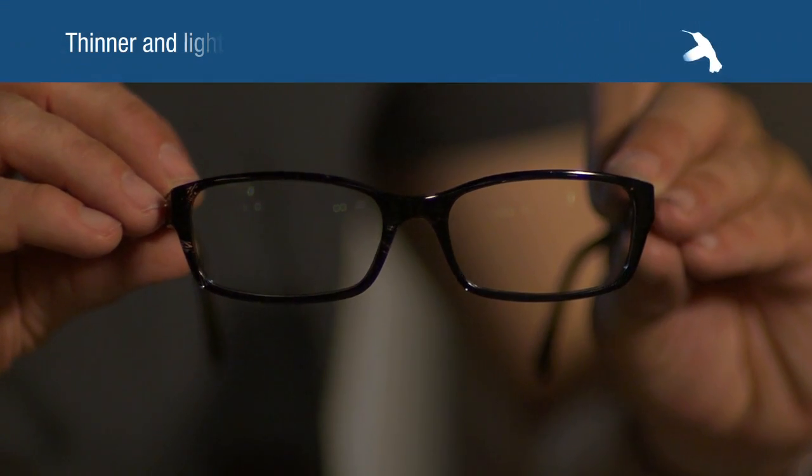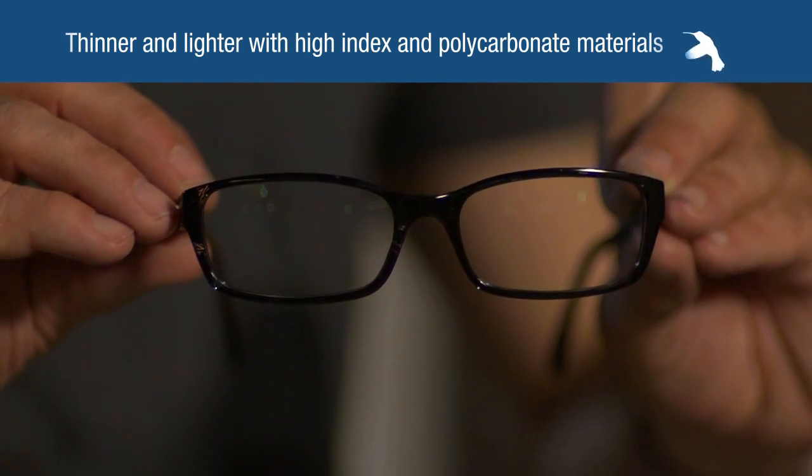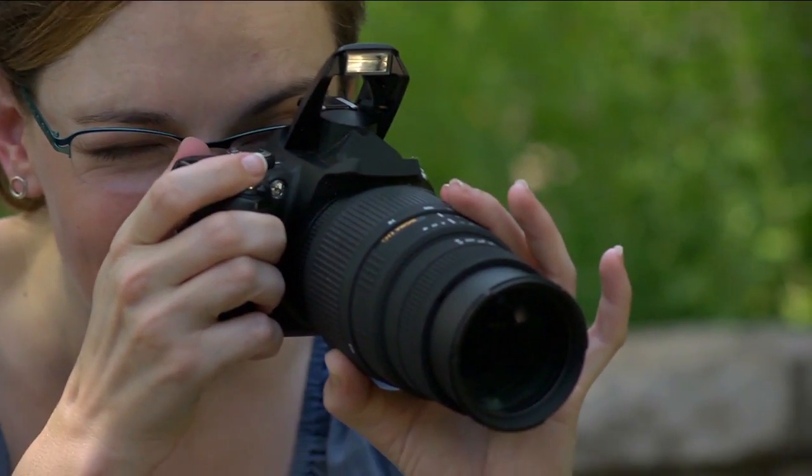New Essilor 360 single-vision is thinner and lighter with high index and polycarbonate materials, and they provide 100% protection against the sun's harmful UV rays.